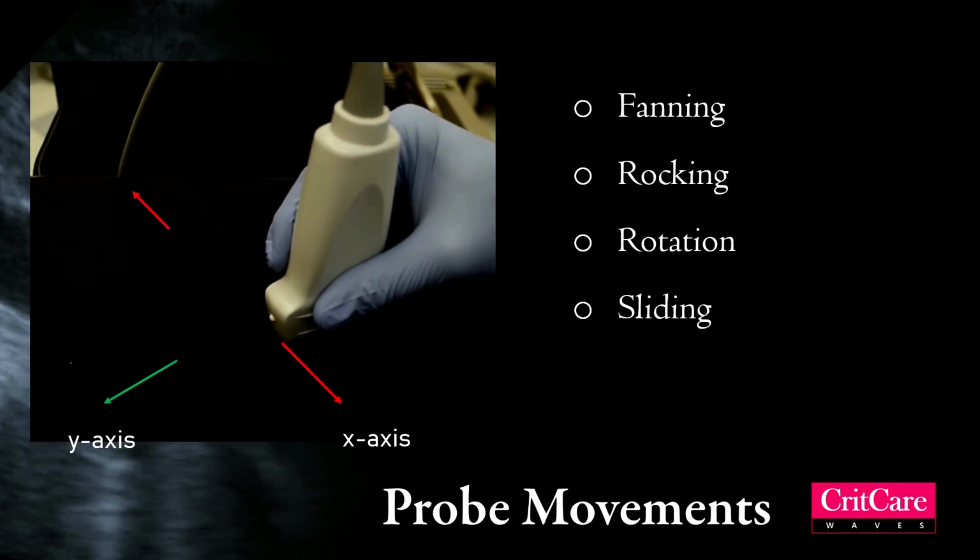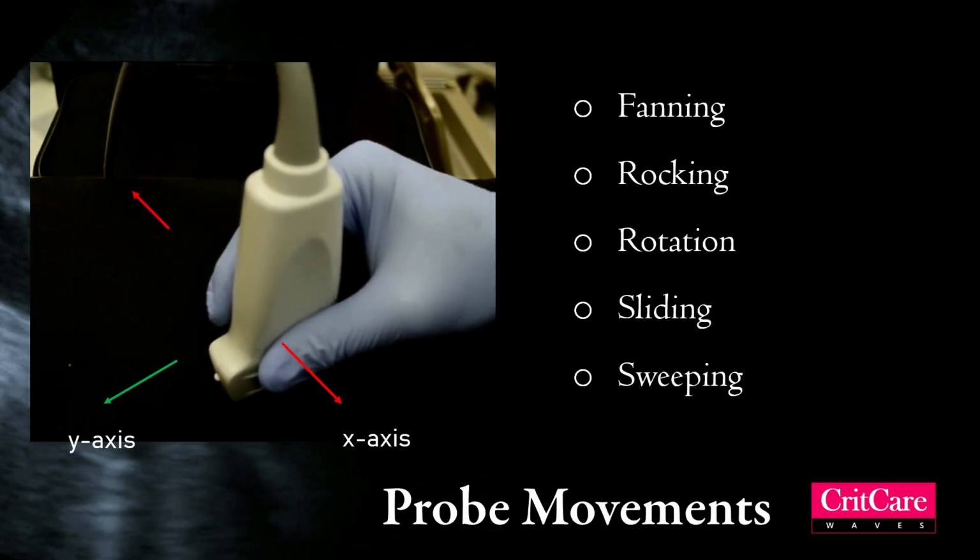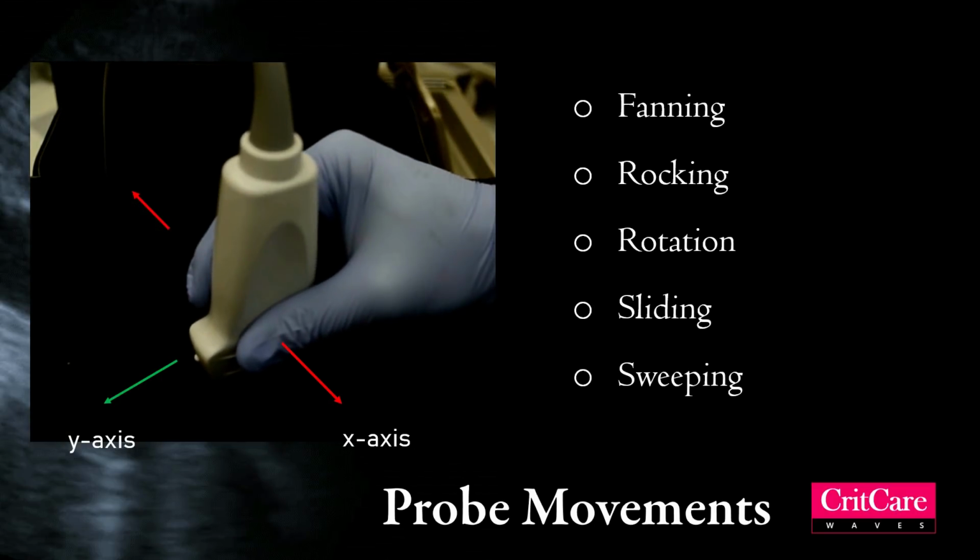Physically moving the probe along the Y-axis is called sliding. Physically moving the probe in the X-axis is known as sweeping. Those are the ultrasound movements that you need to know to get started.